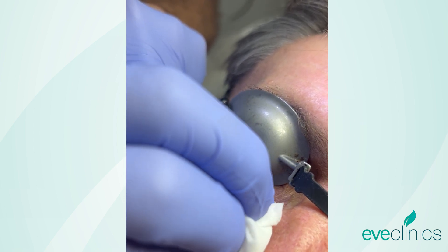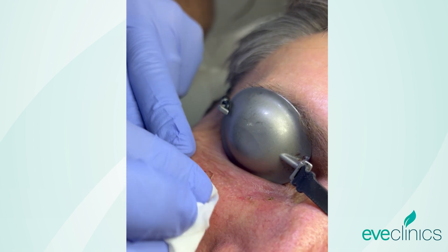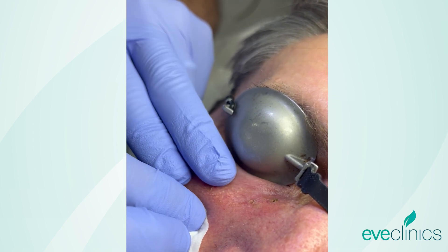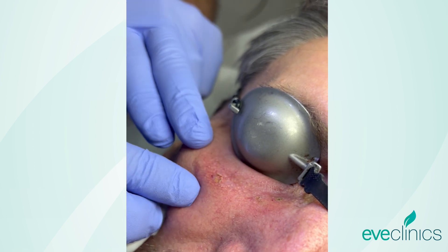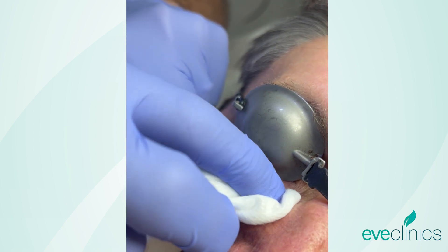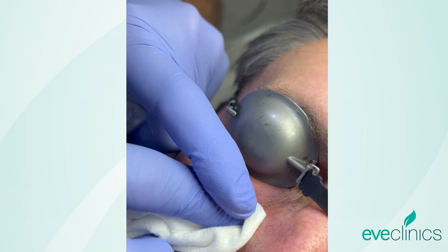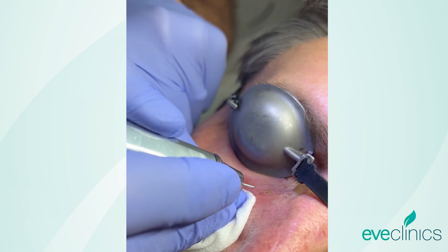And there we go. Perfect. This is amazing — it's not bleeding. No, that's the beauty of these lasers. You've got to love them. Amazing what they let us do. Let's try and finish that central portion off a bit more.